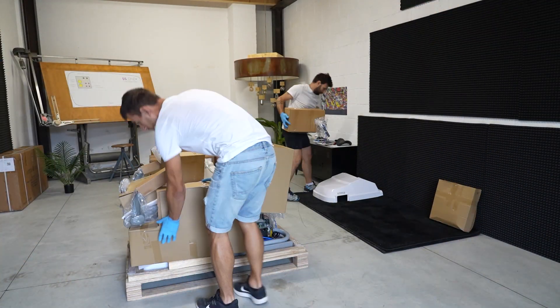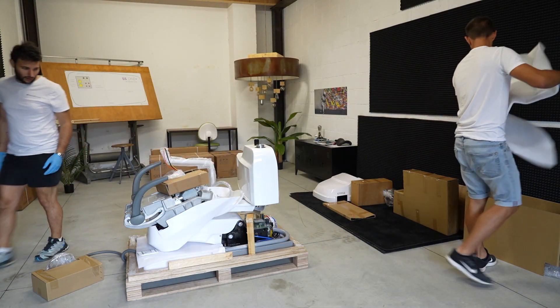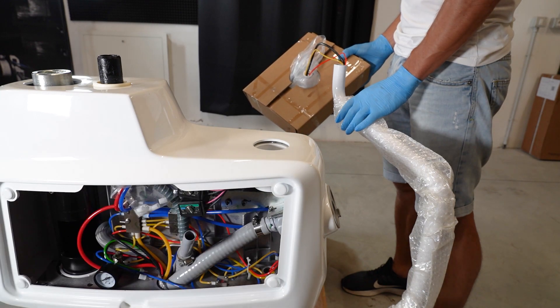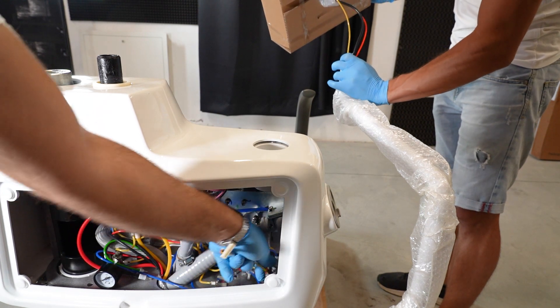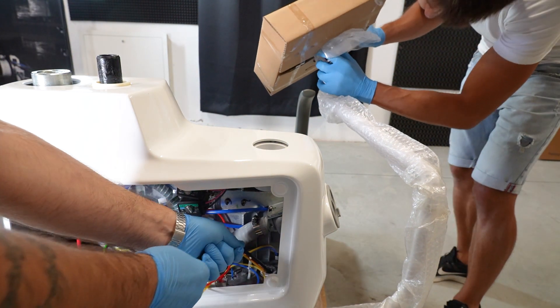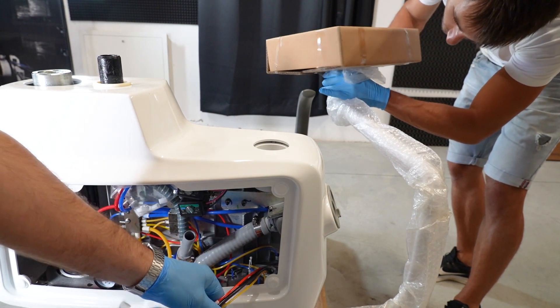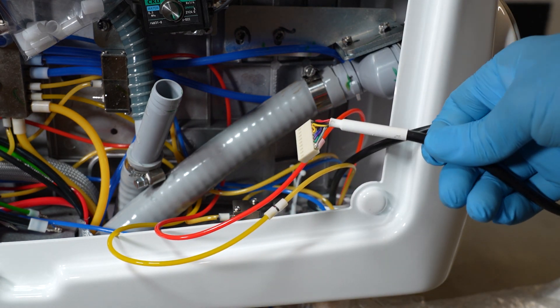Use something soft to rest the pieces of the dental unit on. Open the water unit and mount the assistance tray on its arm. Connect the cable on the water unit control board.